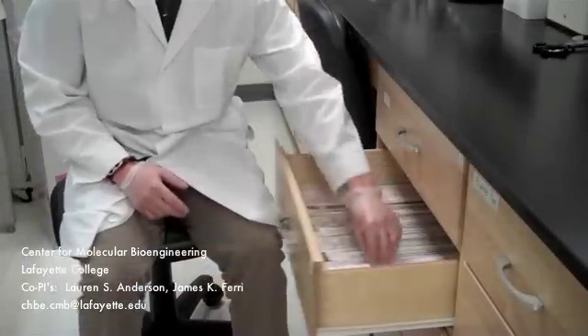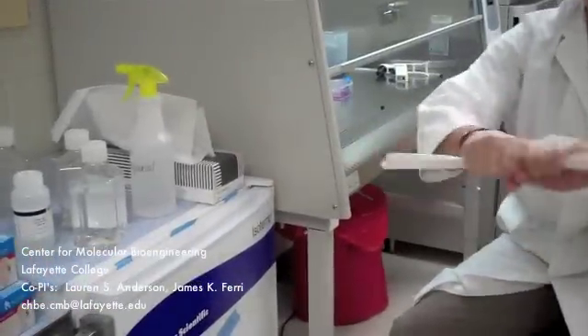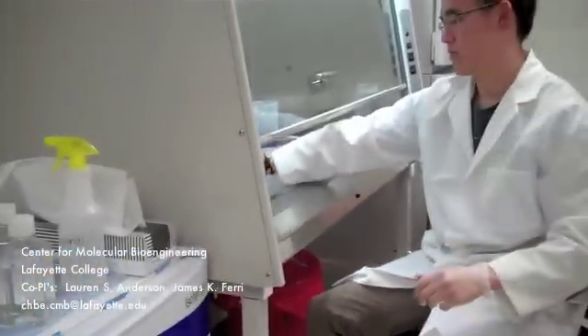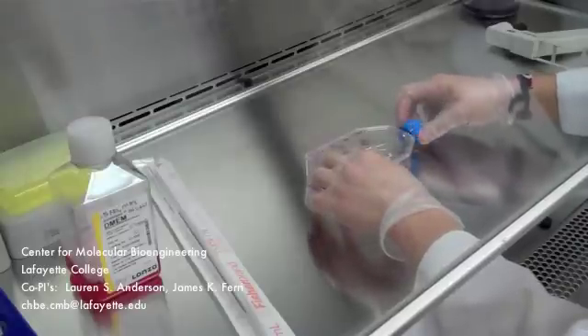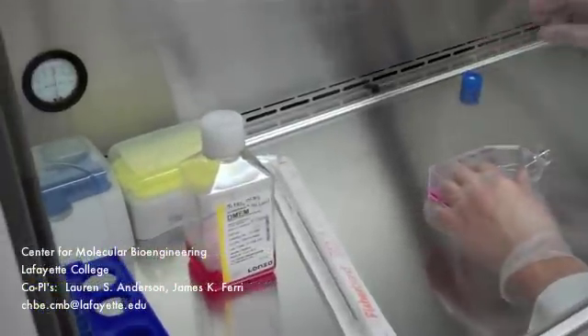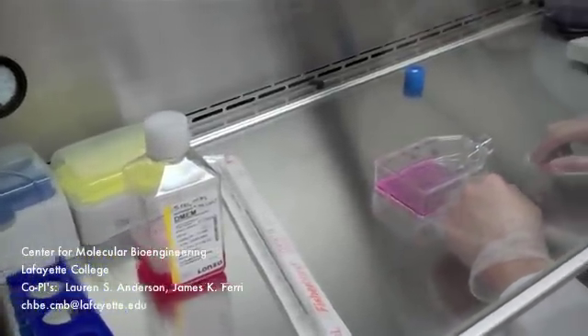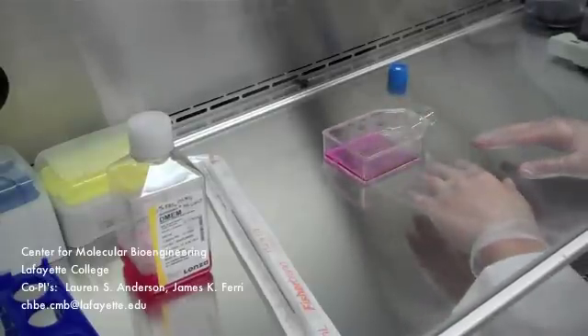You will need two 10ml individually sealed pipettes. Give them a quick spray, wipe them with your hands, and place them in the hood. Begin by twisting the cap of the T75 flask and place the cap face down near the back of the hood. Whenever there is an open container, be careful not to leave your arms or hands over the container.